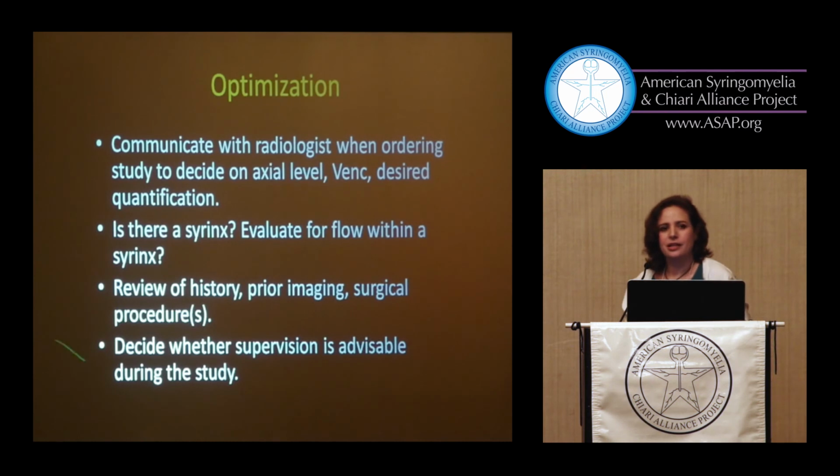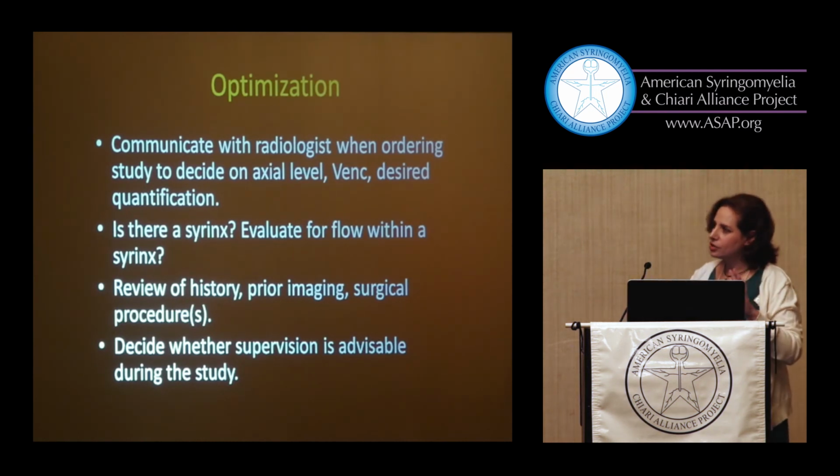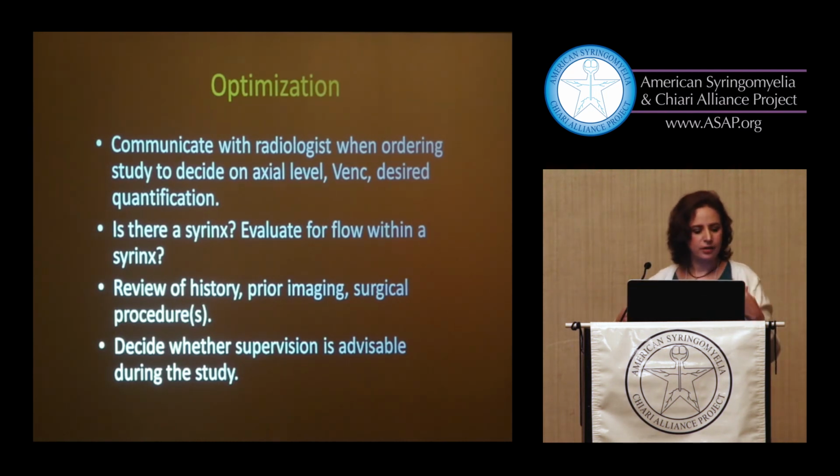So what can we do to optimize this? Well, this is where you have to talk to us, and that's good. I think there's a certain frustration on the part of the clinicians who order this, the surgeons and the neurologists, because sometimes our reads may differ, we think there's a little bit more flow, less flow. That's probably going to be very annoying. So to avoid that, we have to do a better job on our imaging. And I can tell you personally that quite a few radiologists that I know, even neuroradiologists, are intimidated by this technique. So everyone's afraid. There's nothing to be afraid of.